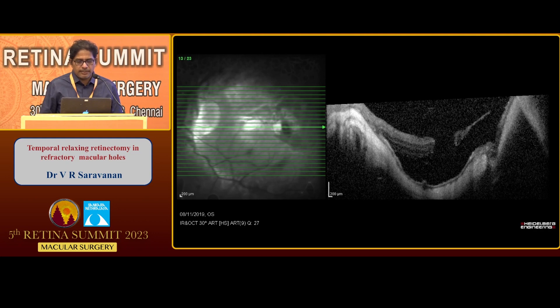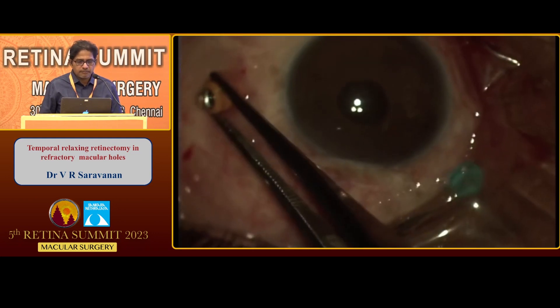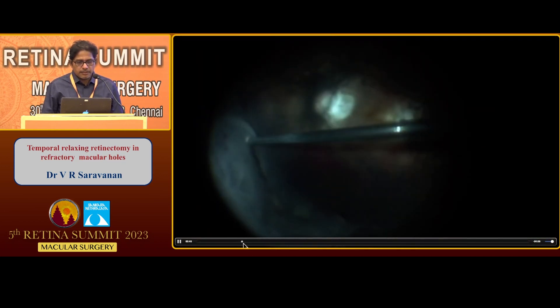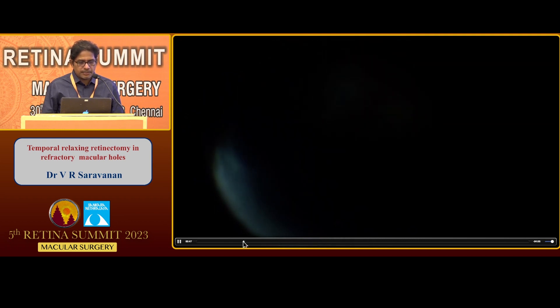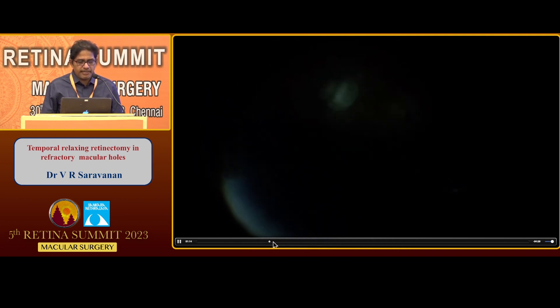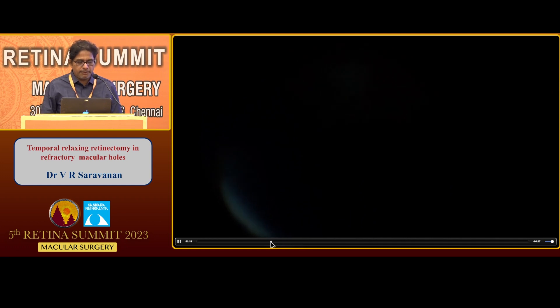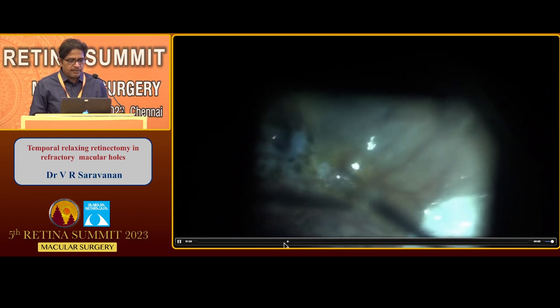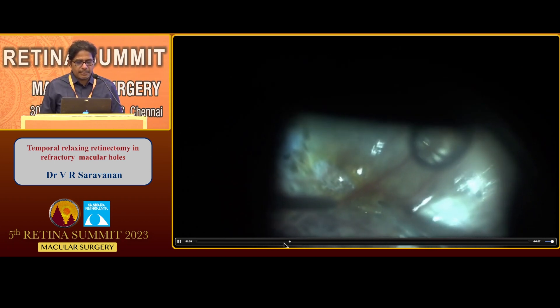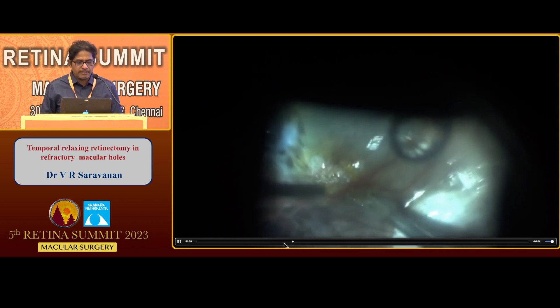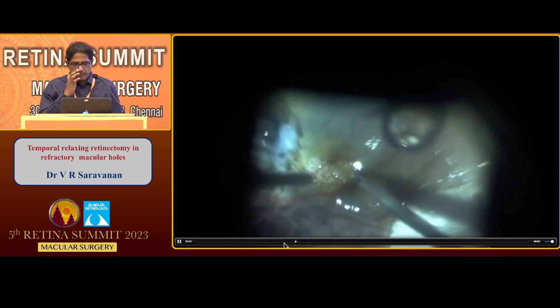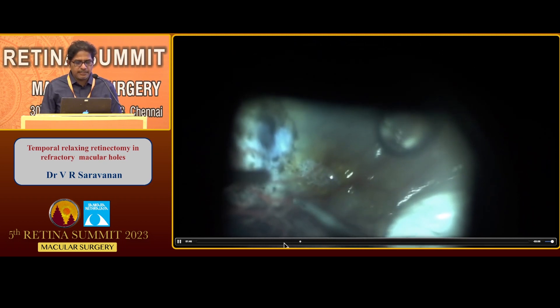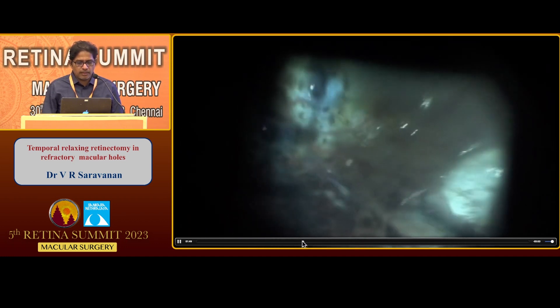You can see the large macular hole on the extremely thin retina at the edge of the staphyloma. After removing the oil, because the RD was extending inferiorly also, I just wanted to release the inferior retina to prevent any contracture of the inferior vitreous base and a second recurrent RD. Here I was trying to peel the ILM, but the ILM was very thin and I was getting only a few bits and pieces — I was not able to get it. My original intention was to do only an inverse ILM flap with a relaxing retinectomy, but I was not able to get a proper flap, as it was very thin and I was not able to get it in a single sheet.